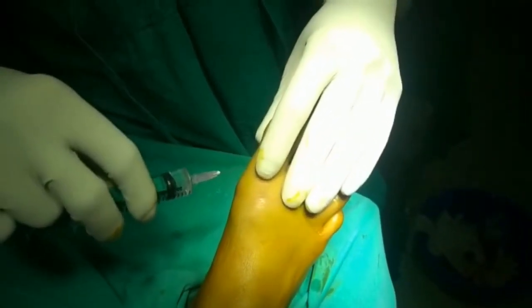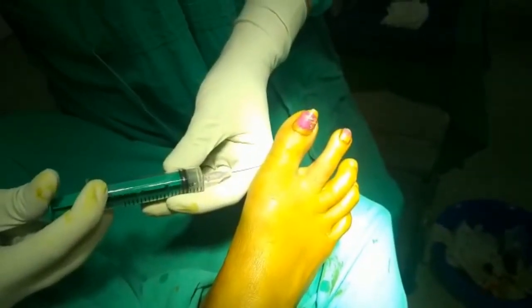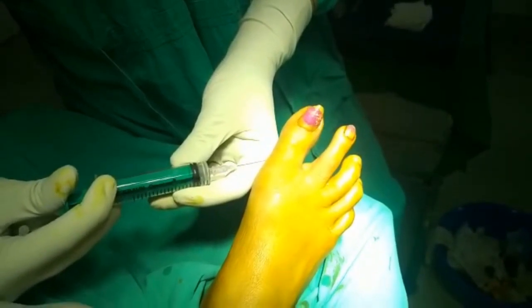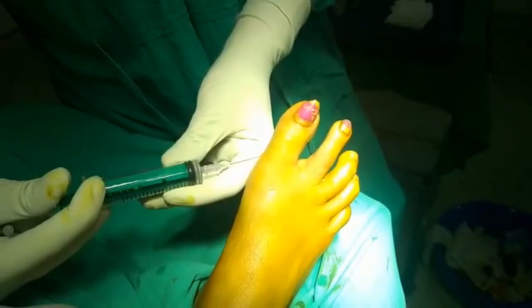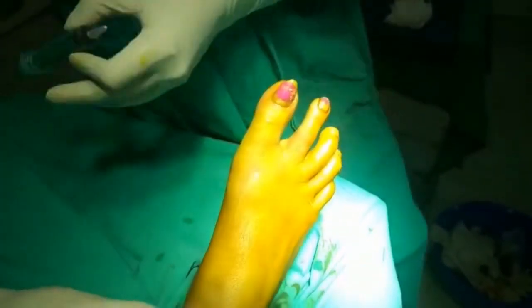Always remember to stay where the color of the skin changes from the dorsal to the ventral aspect when you are entering either the dorsal or the plantar surface. Now wait for 5 minutes for the effect to start.